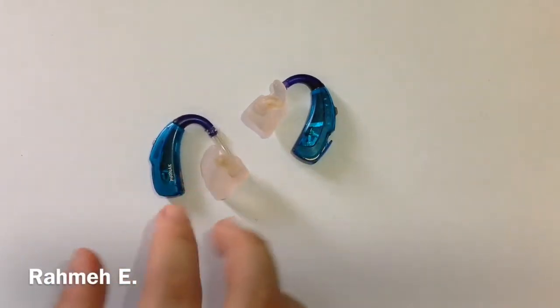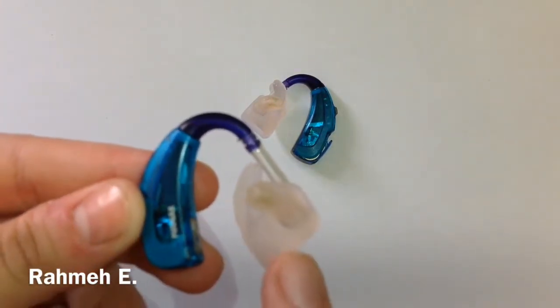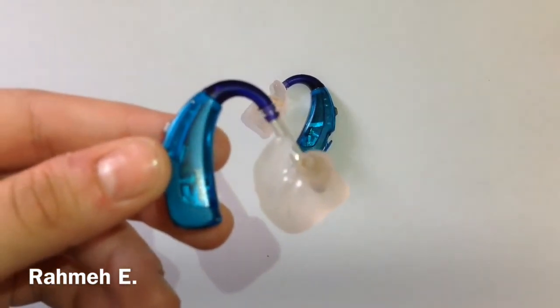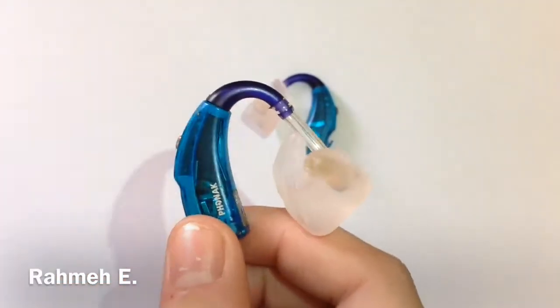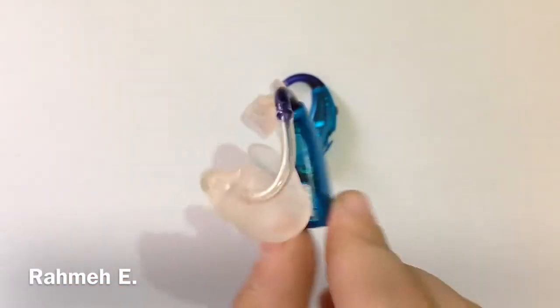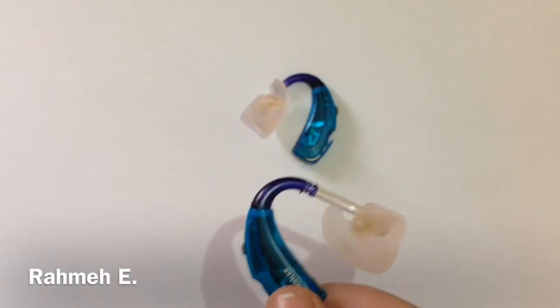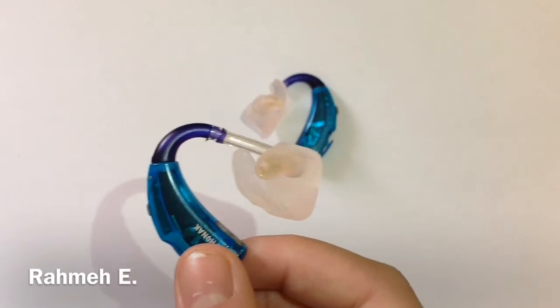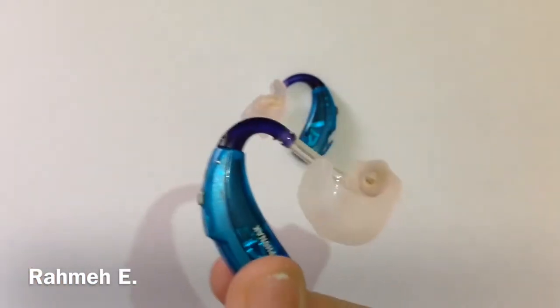So here there's two of them, and the first thing I'm going to show you guys is the ear mold. Each person that wears the hearing aid gets their own custom made ear mold so that it can fit the person's ear right. It's sort of like shoes — as your ear gets bigger, you go in to get fitted for a new ear mold.